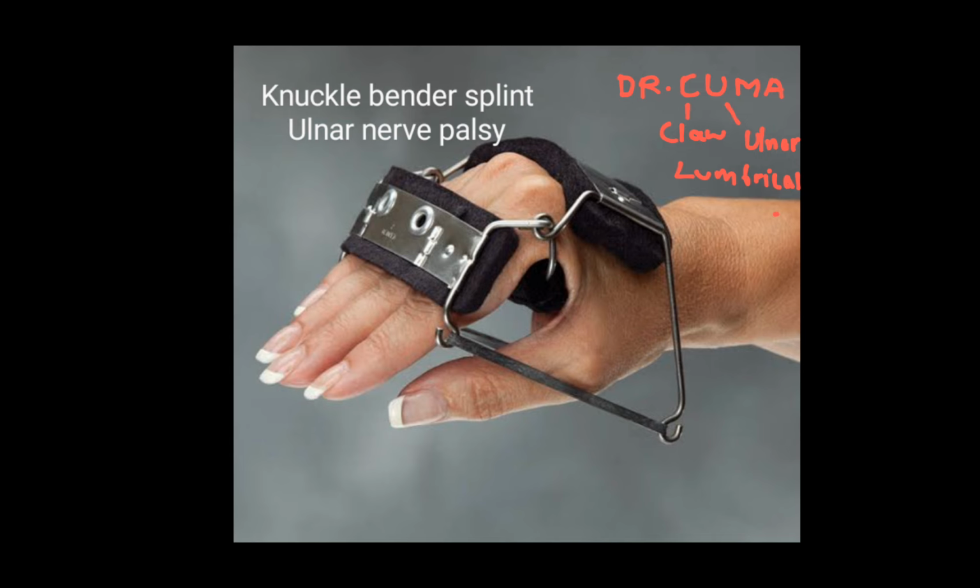Ulnar nerve supplies the lumbricals, and if the lumbricals are not functioning, then we need to use a splint that will serve the function of the lumbricals. What is the lumbricals' function? That is flexion at the metacarpophalangeal joint and extension at the interphalangeal joint. Knuckle bender splint, to bend the knuckles for ulnar nerve palsy.